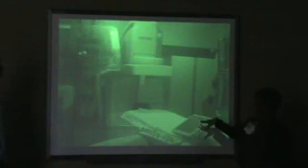This is a picture that I took in the endo suite at the University of Chicago. This is a bi-plane C-arm, which takes pictures in two different views, AP and lateral, simultaneously. And this is the bed in which the patient would be laid on and prepped on.